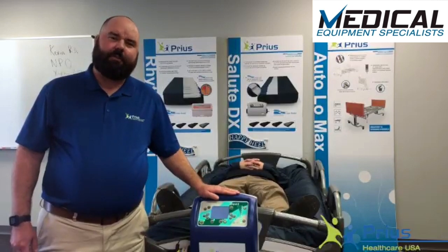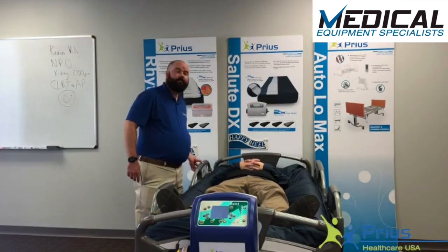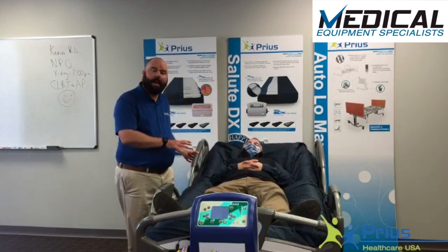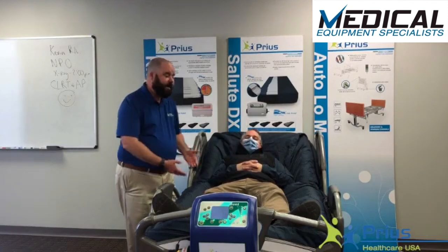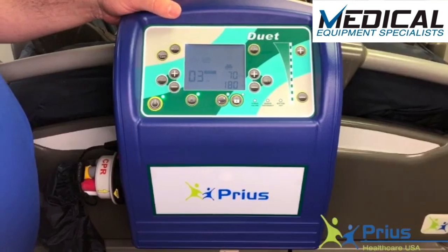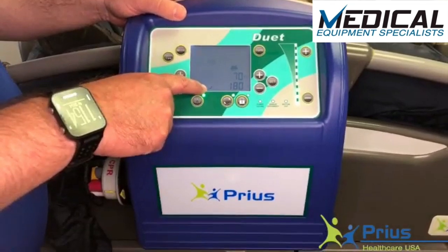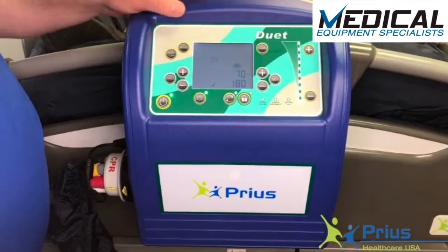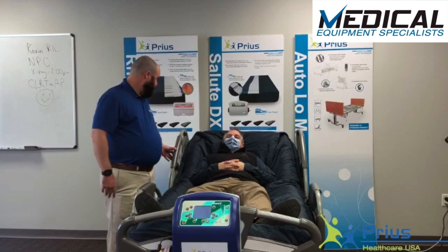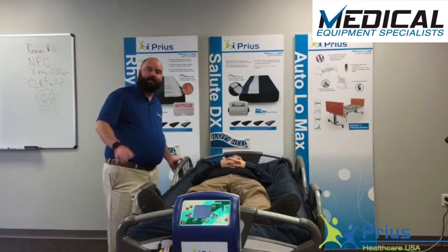Another unique feature of the Duet mattress system is the auto-fowler function. When I raise the head of the bed above 15 degrees, the system will automatically kick on the fowler. The amount of air raises in the patient's midsection so they're less apt to bottom out. The indicator for the patient in the seated position means the auto-fowler has been engaged. As I lower the head of the bed back below 15 degrees, it'll automatically return them to the level they were before.